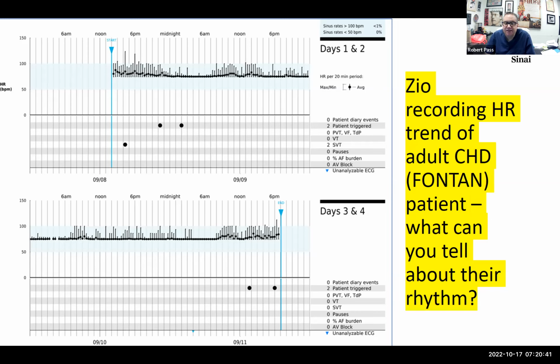And every time he got in his car and was driving, he felt his heart racing, and it was driving him absolutely crazy, even though the settings that we put on his pacemaker were exactly the same as his prior epicardial system. What we discovered was that the small amount of rate responsiveness, which had always been on his device, was so much more sensitive when it was in his shoulder that with the jostling of the car, hitting potholes and things like that, his heart rate was going up to about 80 to 90 beats per minute from the lower rate limit, which was like 60. And he was very, very uncomfortable. So we had to turn that off, and as soon as we turned it off, he immediately felt better. So one has to be careful with this.